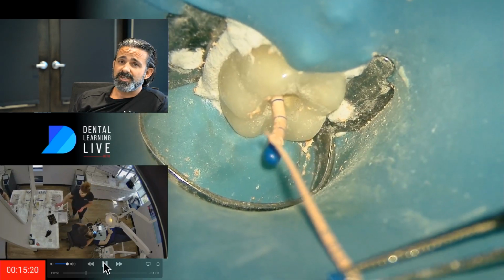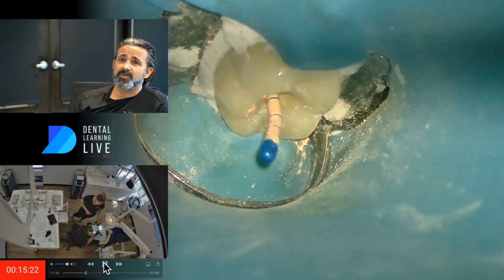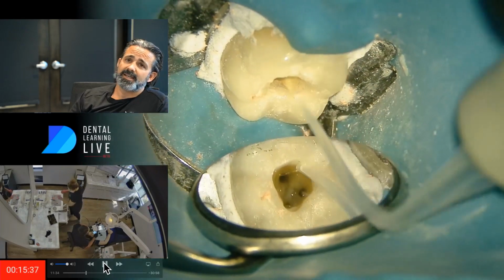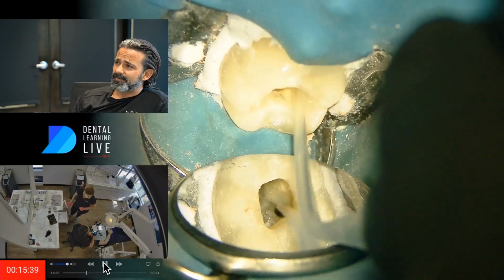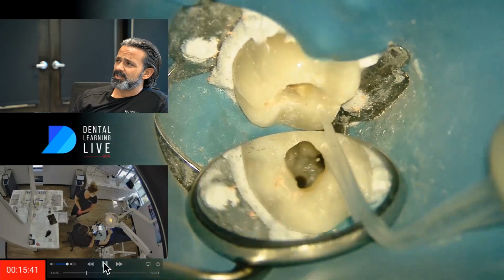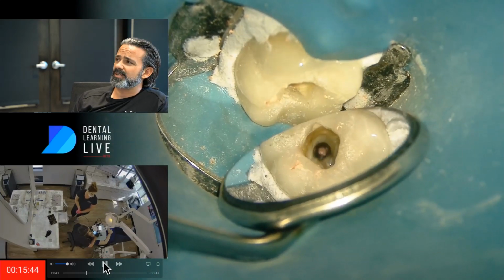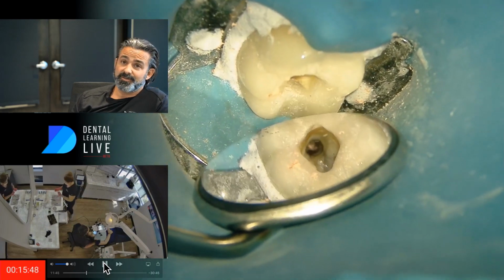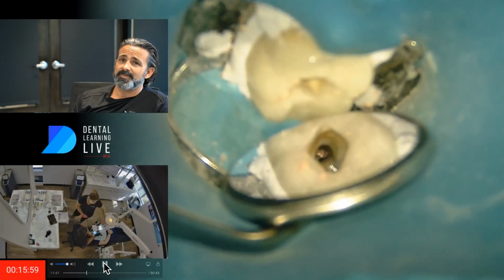You know, I have a choice when that happens. I trim it to the crinkle, or I go up to a larger size gutta percha. And in these cases, I actually trimmed my cones. So now what I'm going to do is just look and see without any liquid in the canals, and there you go. Not all the gutta percha is out. Enough to get a 35 cone past it, but up there in the isthmus space, I'm seeing gutta percha.